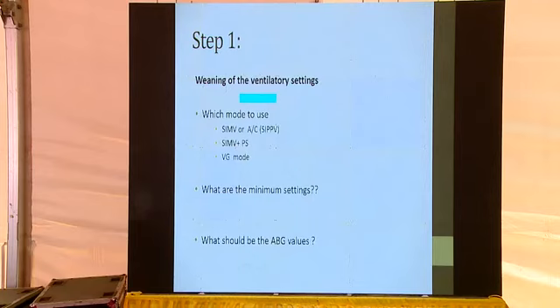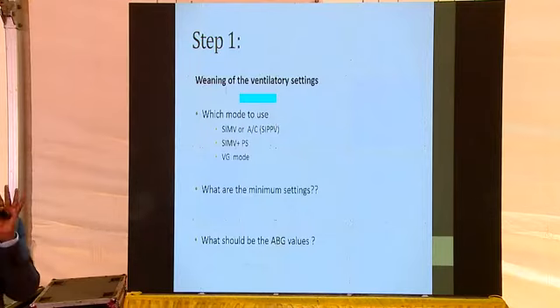I do not want a normal blood gas, because if I am in the process of normalizing the blood gas, I will spend more time on the ventilator and delay my extubation. It's okay. If the pH is more than 7.2 to 7.25, go ahead, no issues. Don't increase the pressures, because you don't want the ABG to come back to normal.